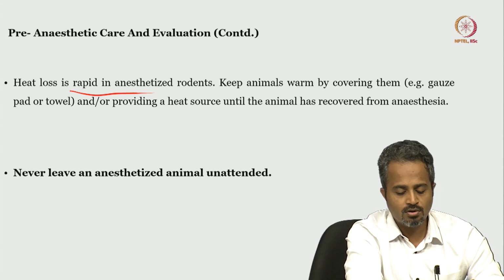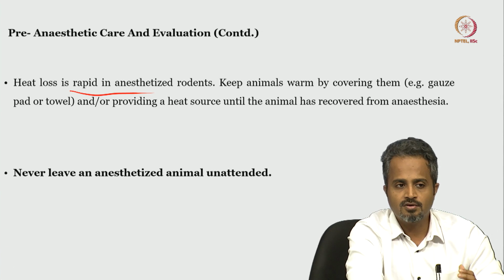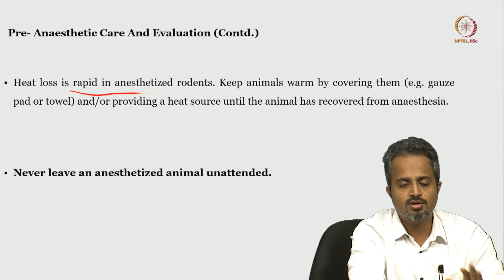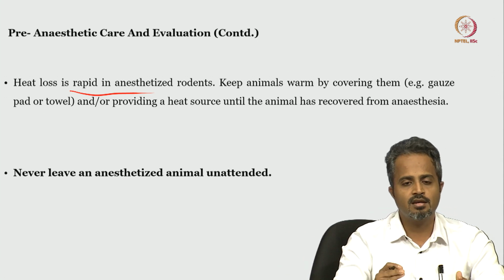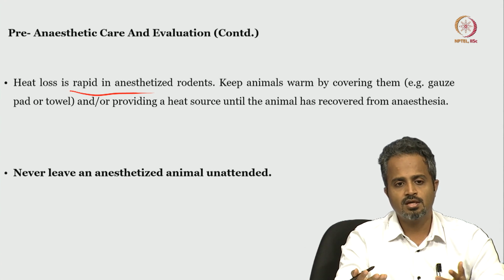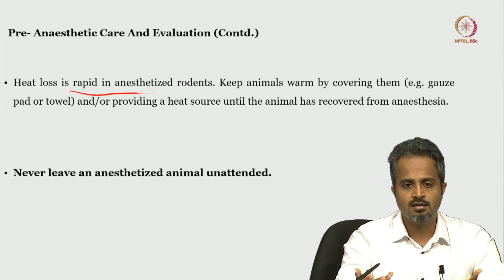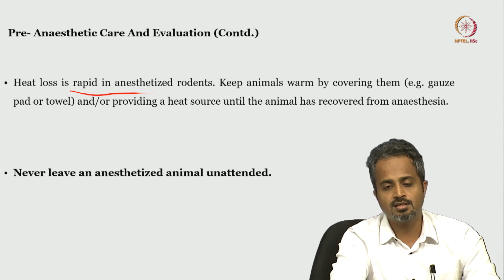And most importantly, we should never leave an anesthetized animal unattended. If your surgical setup is not ready at the time of anesthesia, you should ensure that the entire surgical apparatus is ready, so that you can quickly transfer the animal to the surgical apparatus and start your procedure, so that the anesthetized animal's time is not wasted. Otherwise the animal is going to breathe in a lot of anesthetic gases if you keep preparing the surgical setup after inducing the anesthesia.